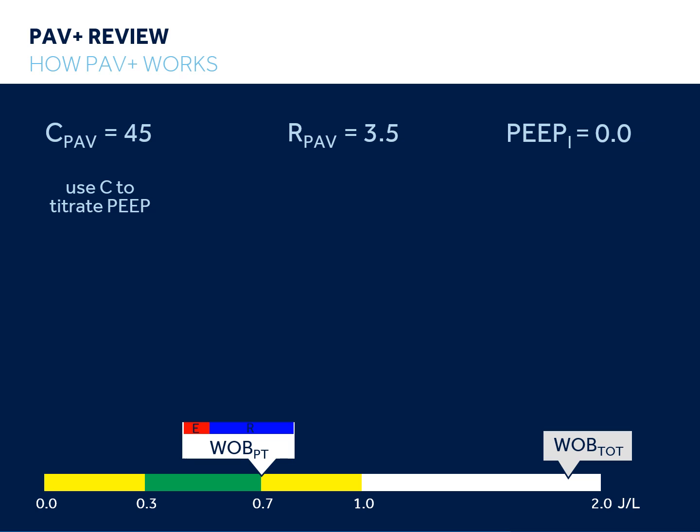Recall from previous slides that allowing the diaphragm to do too much or too little work causes diaphragm injury associated with prolonged mechanical ventilation, and also recall how challenging it is to tell the difference between a normal work of breathing and no work of breathing at all, or anything in between, simply by visually assessing the rise and fall of the patient's chest during mechanical ventilation. As such, clinicians may find it valuable to have an indicator of patient work of breathing to be able to target work levels that are neither too high nor too low, and thereby aim to prevent the diaphragm atrophy and injury and prolonged ventilation associated with non-normal work of breathing.